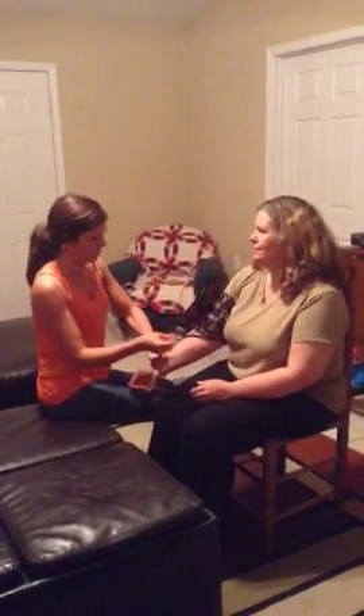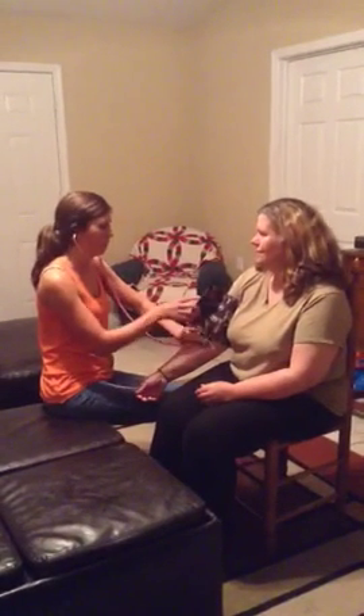If somebody has high blood pressure, you will try to get it between 180 and 200, because normally their systolic number is in that range. A good blood pressure, they say, is 120 over 80. You will then put your stethoscope on and place it in the crease of the arm, and pump it up to between 160 and 180.